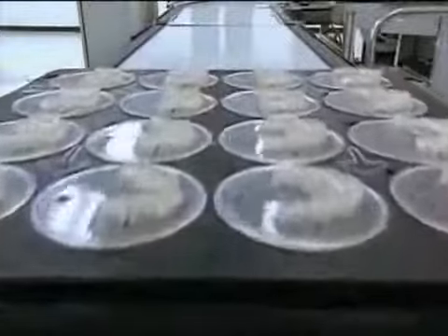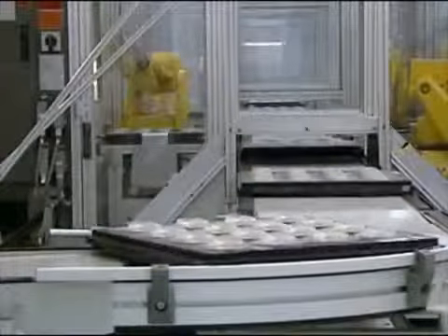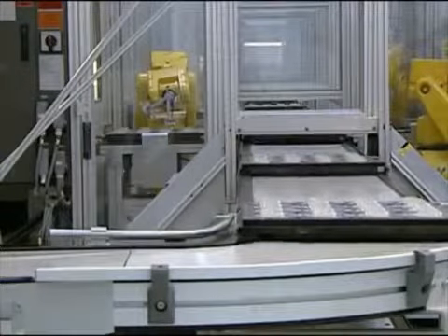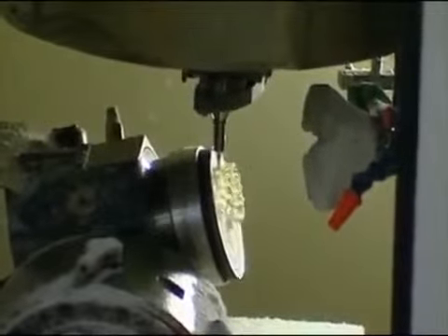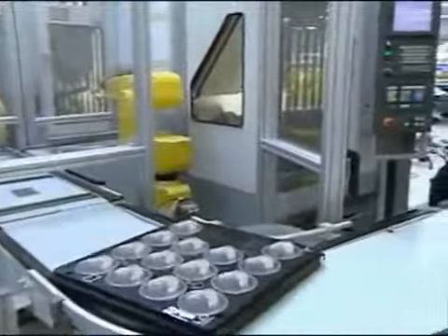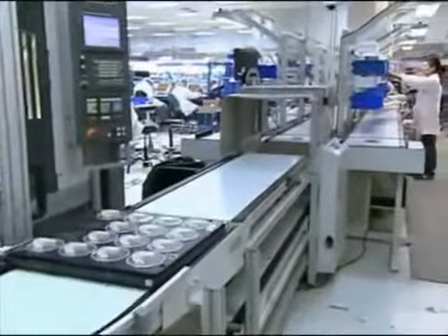The newly formed aligners are then released to the trimming function, which relies upon virtual data that you approved in your ClinCheck to trim the gingiva line. In real time, the machines automatically pull up that approved treatment data so that we can cut each aligner to your specifications. Once we've completed the process, we have to get the aligners for that given patient all back together.